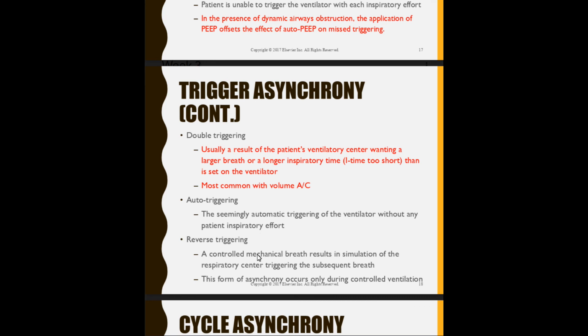What's happening here? I trigger the ventilator to give me breaths, so I'm breath stacking. I'm not sure if you guys have tried breath stacking. It's a horrible sensation. I've tried it, and I'll probably make you do it in class so you understand what double triggering is. But most of the time, this is how our COPDers breathe. They might be used to it, but for those of us who are not COPDers, double triggering is very, very uncomfortable.